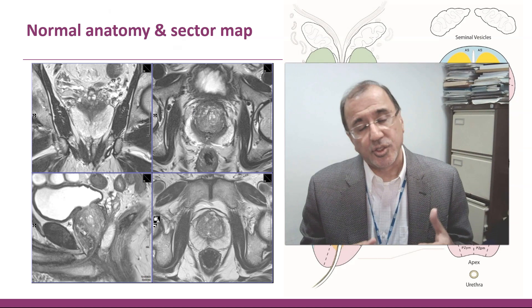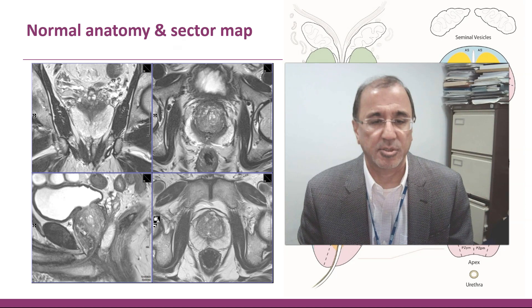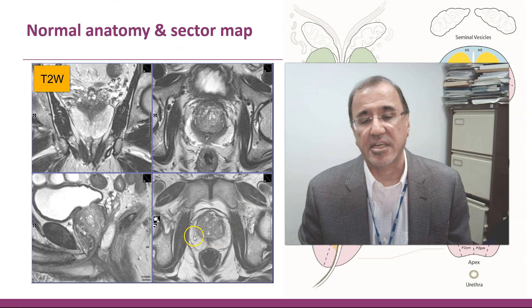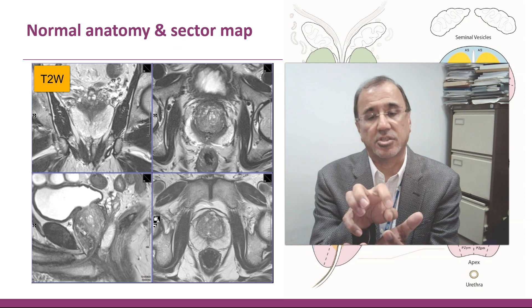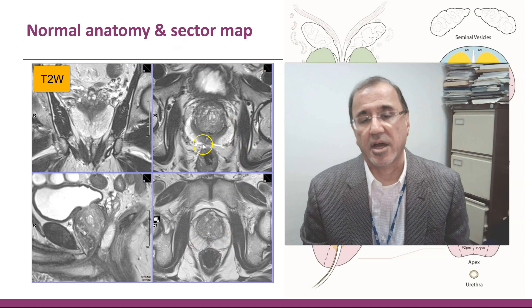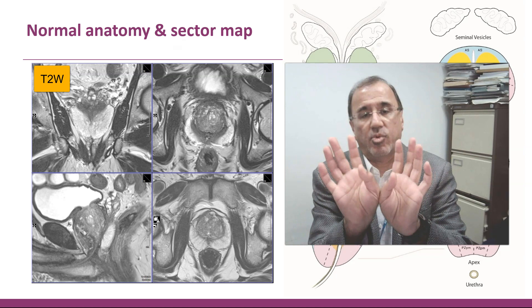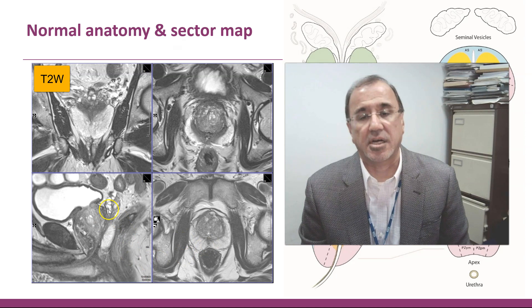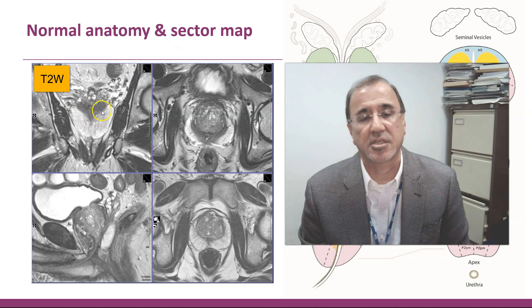When you look at a prostate gland, what is the normal anatomy being displayed? We have the peripheral zone, which is high signal intensity and looks like a cup within which sits the transition zone. At the back, we have the central zone with the ejaculatory ducts. You can see how the central zone inverts and reaches a sharp point towards the verumontanum.